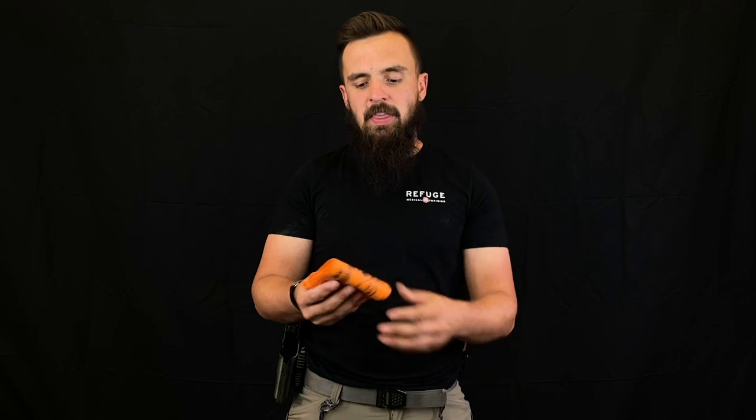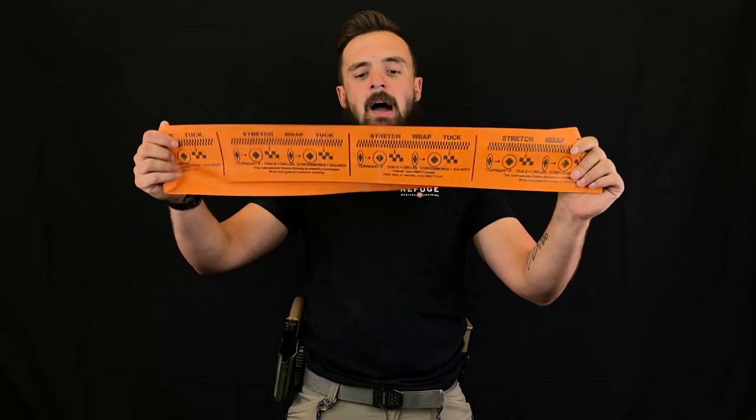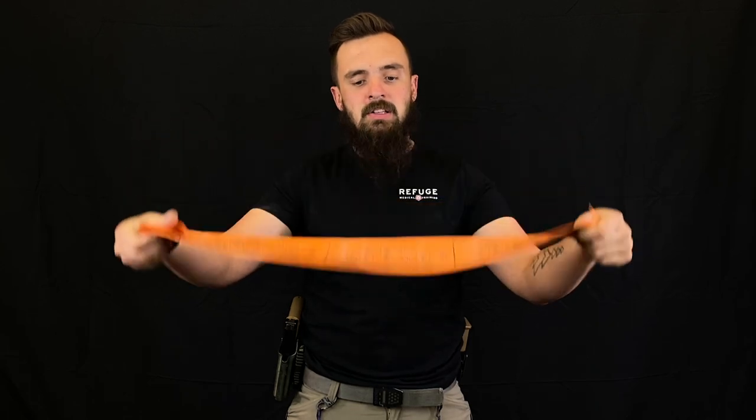The S-Mark is an awesome option that we supply in a majority of our kits. The main difference is going to be the length and the thickness — the mil of the plastic component in this elastic. With that, you have a SWAT-T right here. The SWAT-T is a little bit longer than the S-Mark, it's also thicker, and it has directions on the outside: how to stretch, how to wrap, and how to tuck.